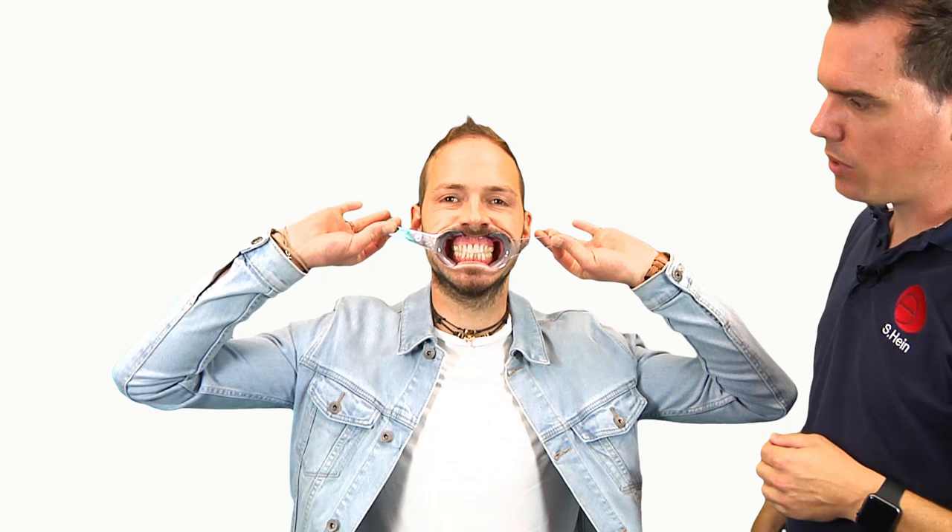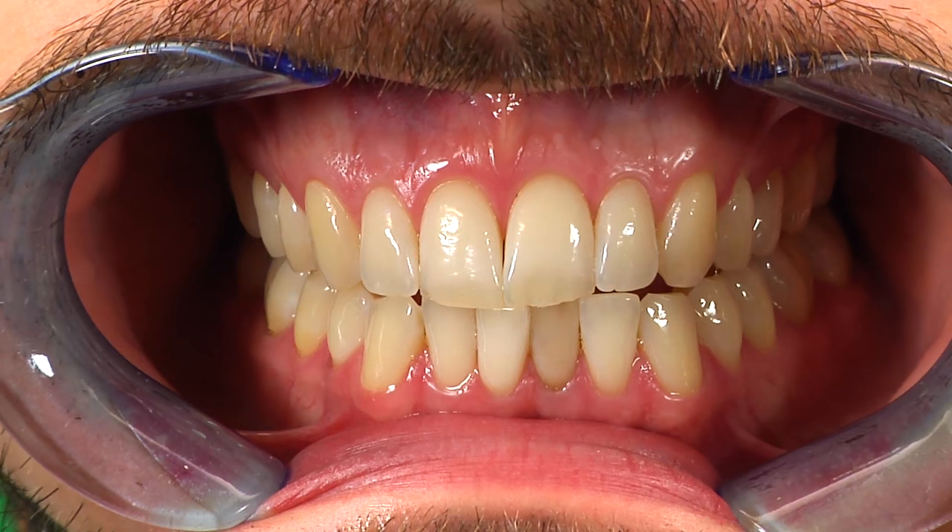Tell the patient to move the mandible forward so that it is in an edge-to-edge position with the maxilla. Then place the white balance square reference card in the middle so that its midline aligns with the vertical midline of the patient.